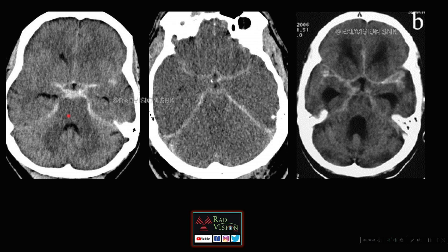In this first case, you can see there is a hyperdense collection noted along the sylvian fissures, in the basal cisterns, and along the tentorial leaf. This is a case of subarachnoid hemorrhage (SAH) in a hypertensive patient. In a similar-appearing case, there is diffuse cerebral edema with relatively hyperdense sylvian fissures.